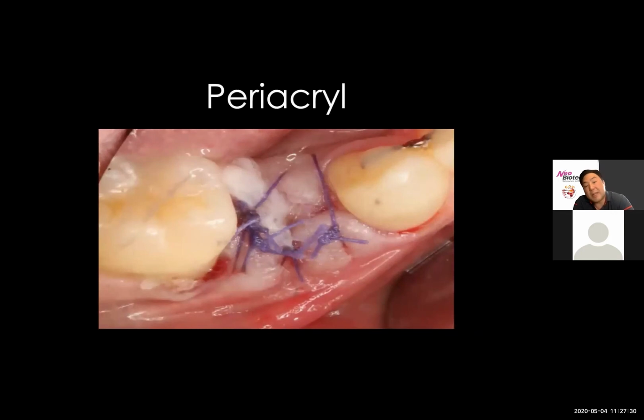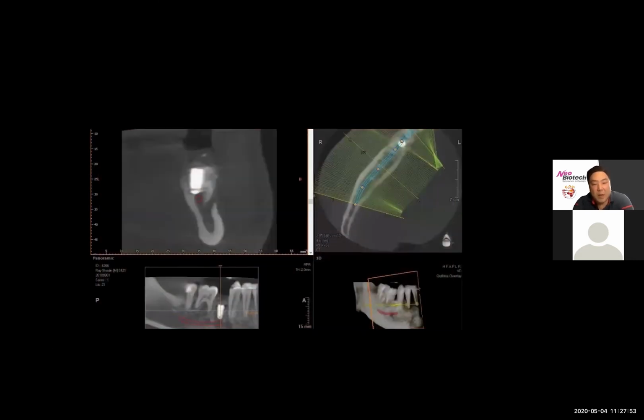But looking at the soft tissue profile here, you can see the patient actually had a decent band of keratinized tissue, right? So by making my incision to the lingual and understanding that for this case we're going to treat this as a two-stage approach, but looking at where the mucogingival junction and where the keratinized tissue is, we have a decent band of keratinized tissue present. So for this case, we did some GBR with implant placement. Maybe we didn't have to do some soft tissue augmentation.